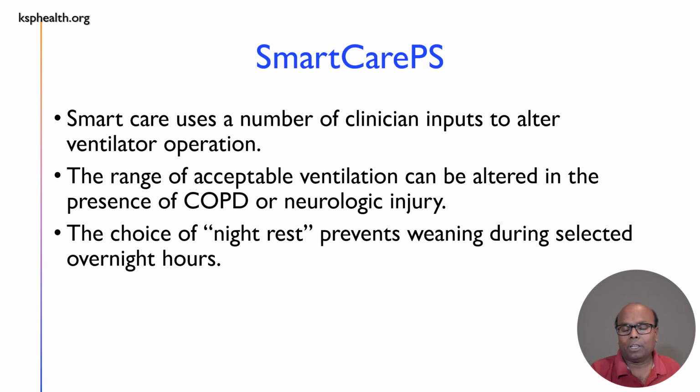And also it incorporates the night rest, meaning the other ventilators don't care. Day or night, it does the same thing. But SmartCare PS gives a night rest phenomenon that is incorporated into it. As I said, I do not have any personal experience with SmartCare PS, but it is a good ventilator for weaning protocols and also in specific populations like traumatic brain injury.